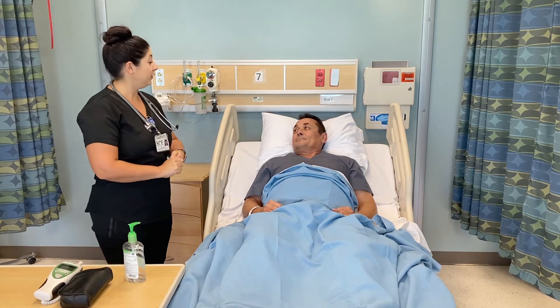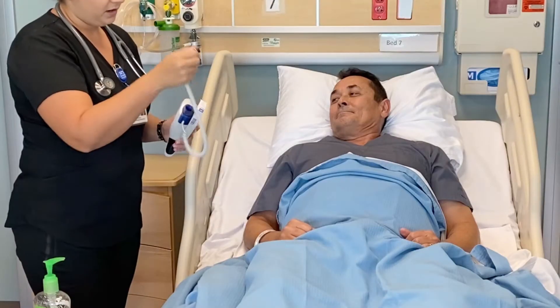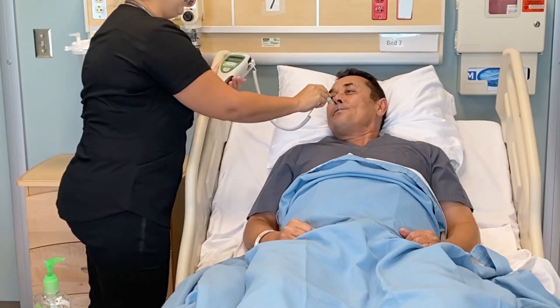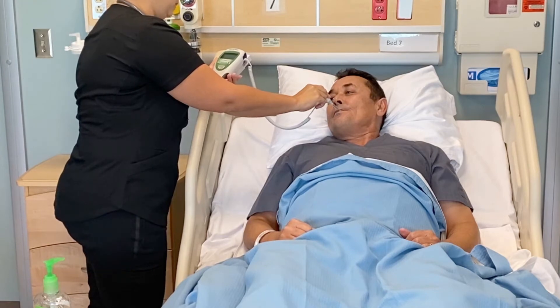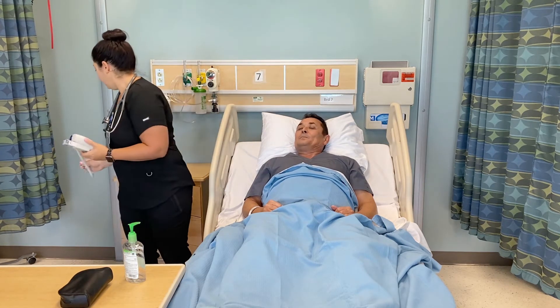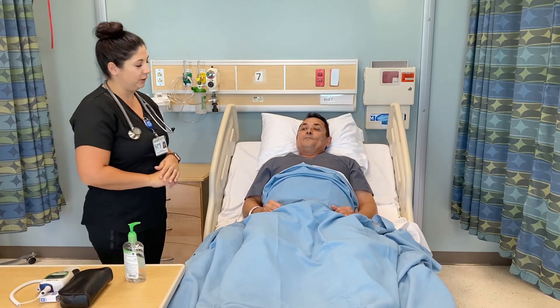First we are going to start by taking your temperature. Have you had anything to eat or drink in the last 30 minutes? No, I haven't. And have you smoked anything? No. I'm going to put a sheath on here. I'll have you open your mouth — putting this in between your teeth and underneath your tongue and we'll wait until it beeps. Remember not to bite down on it. We are going to dispose of this in the trash can and I will write down my findings so I remember them.